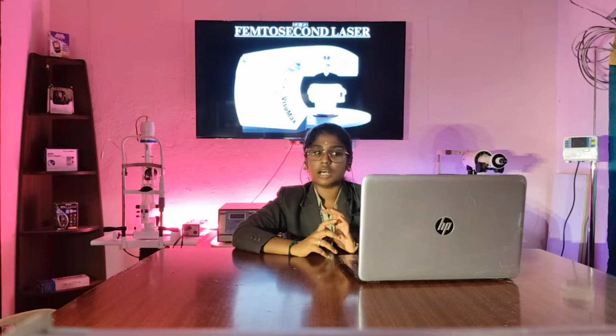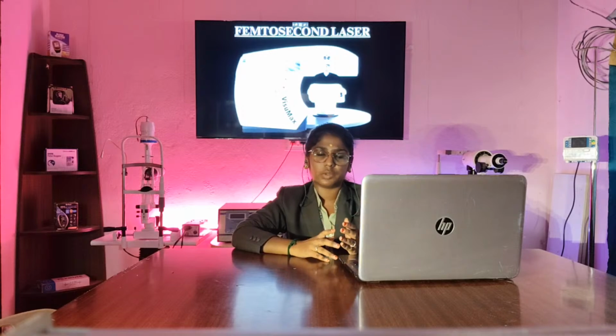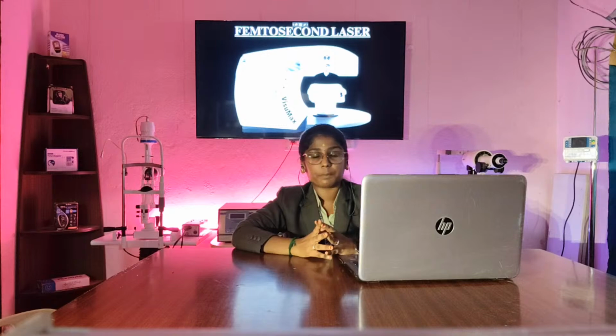Because this laser equipment uses light impulses. It is not using any kind of radiation, like X-ray or gamma radiation. It is a simple format. As we use an illumination system to diagnose, the same illumination light will be used to cut the internal parts also. Once the patient is fixed in a bed and they want to go for a surgery within 2 to 3 hours, they will not be cutting or repairing it with a normal knife. It would be very harmful to the patient and would cause more impact also.